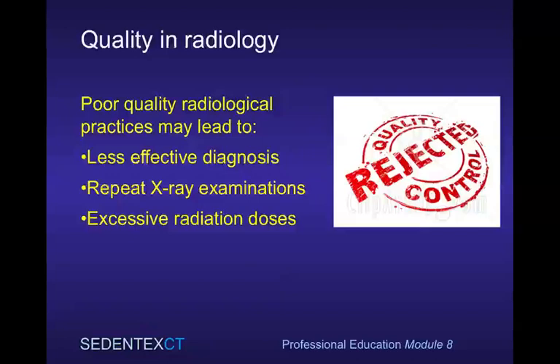Quality in radiology is of obvious importance. Poor quality radiological practices can lead to less effective diagnosis, repeat X-ray examinations, and excessive radiation doses to patients.